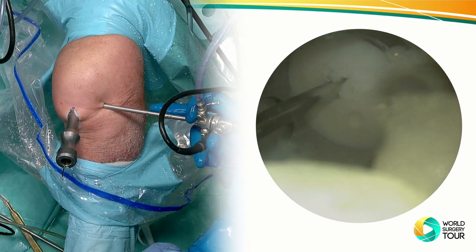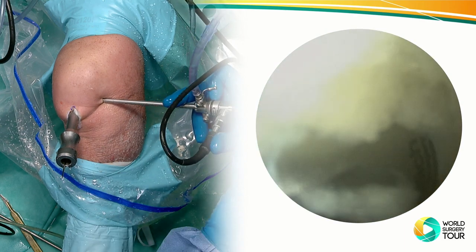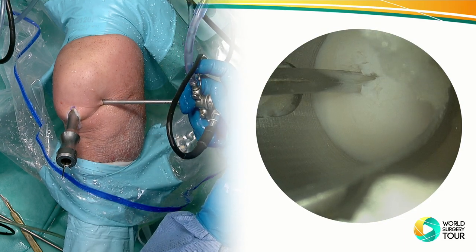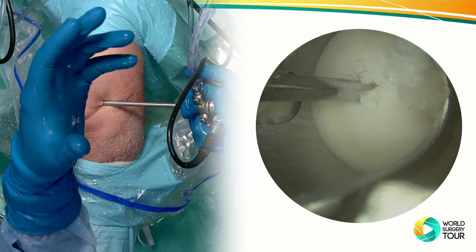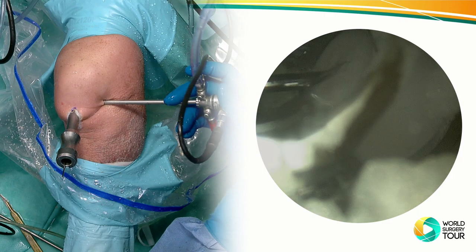So when we remove the water, usually the whole thing collapses. Now, since you have the trocar placed, it should not give you that headache because you established a solid environment around it. So that now we're going to, is there suction?